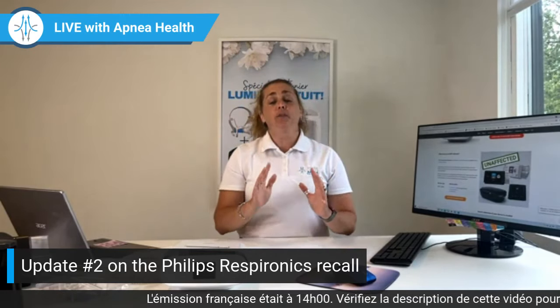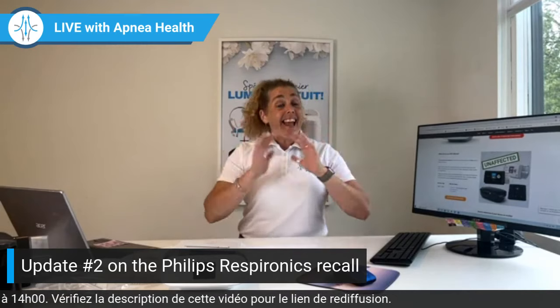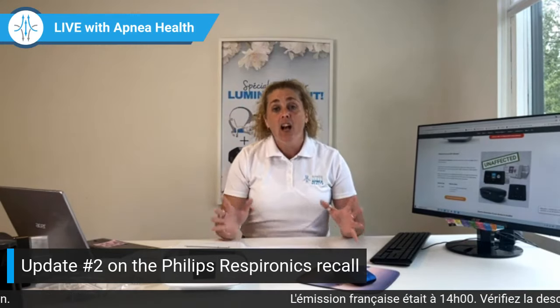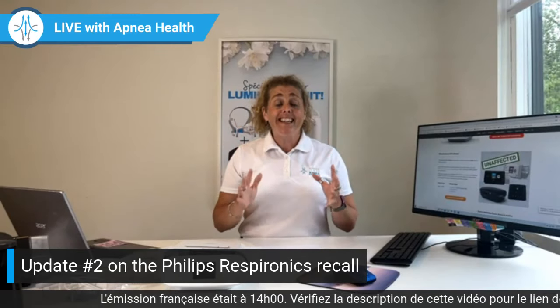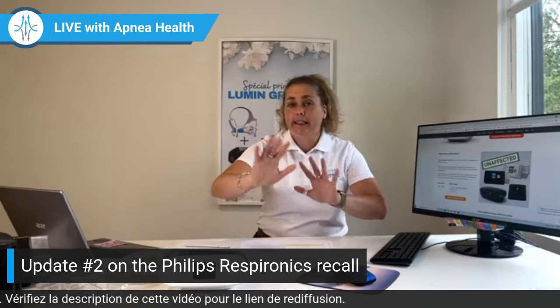So I'd like to mention first, we've never used the ozone cleaner in any of our rental units because we didn't believe in that product. We tested it, but we didn't believe in it. So we did not use any of the ozone products or cleaners in our rentals. So that's also good news. So let's take a look.